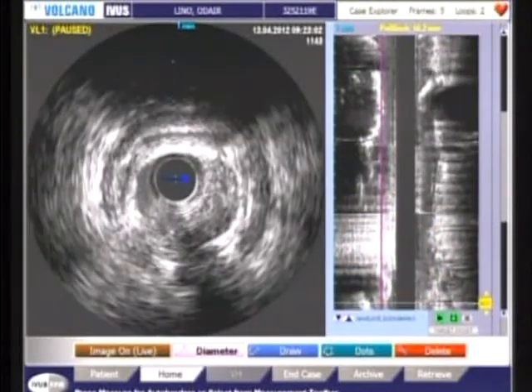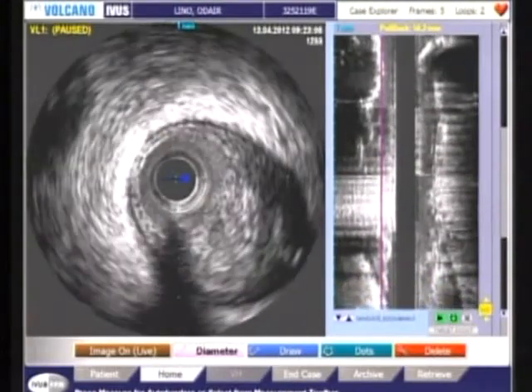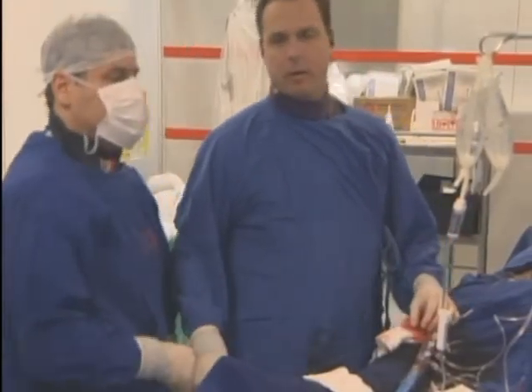So that's the stent. It's a previous stent. There is restenosis here. You see that's a tight lesion inside of the stent, but you also have this plaque, which is a huge plaque burden. Positive remodeling, very eccentric plaque. There is fibrosis, but mostly lipid soft plaque. But do you think that the stent is underdeployed, Pedro?